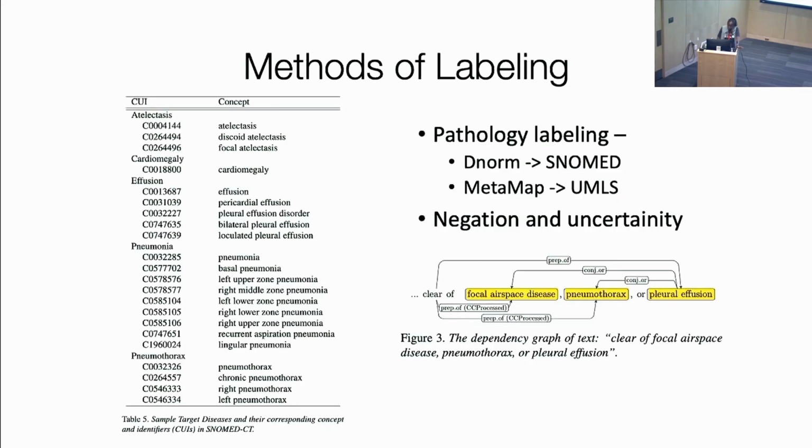So the NIH dataset was trying to do this, to show that they can use this weakly supervised. And then remember I said that to label the datasets, people went to a radiologist, which is not really the right way to do this, and said, show me the 8 conditions that we should label our data set. And so this is another example for the problem of negation, and then uncertainty, as we discussed, in the confidence of the radiologist.